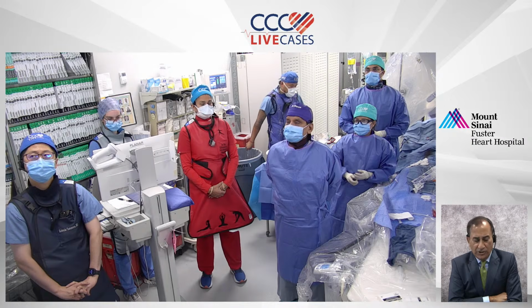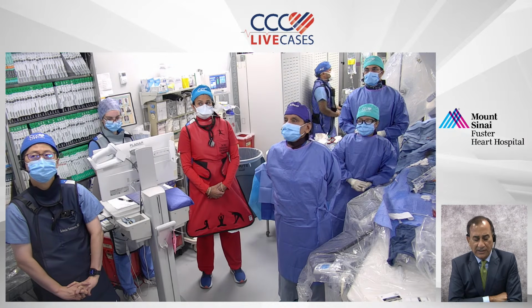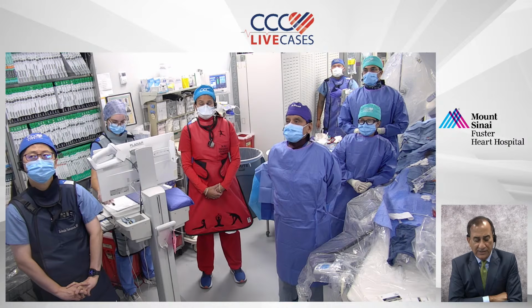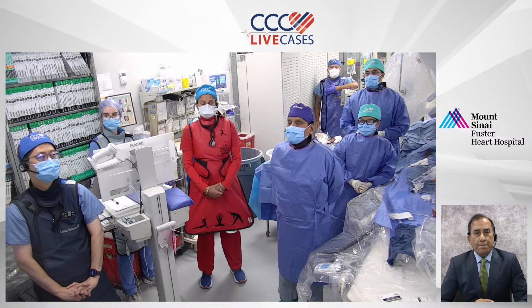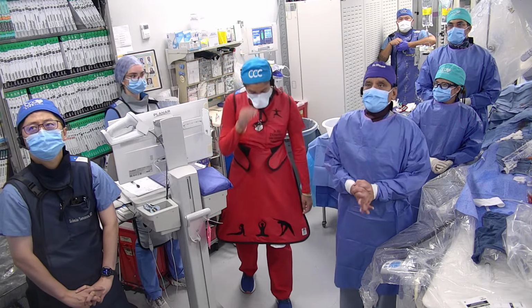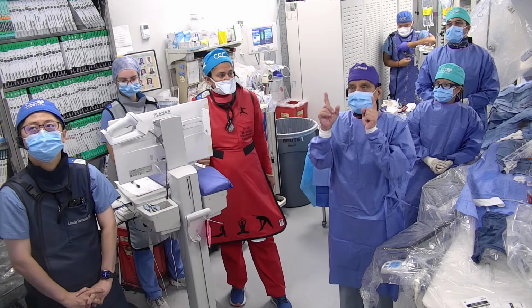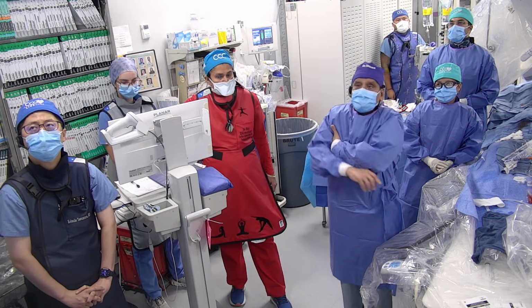Samin, there is a question which has been posed by an individual physician. I'm sorry, this was meant more for a structural case, but the question is, could we use a TriClip for Ebstein's? No, we are not using any because of the situation. The leaflets are totally different. We actually had a few cases of Ebstein's over the years, and they were not appropriate for TriClip. Now, could they be appropriate for EVOQUE, which is the TTVR? That is a different story. I think that maybe, but definitely not for the TriClip.